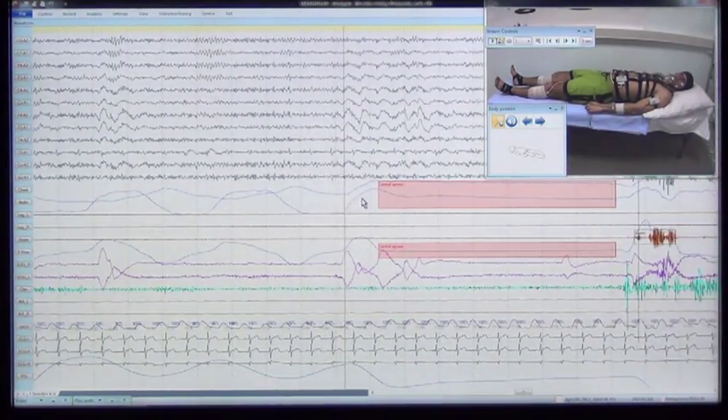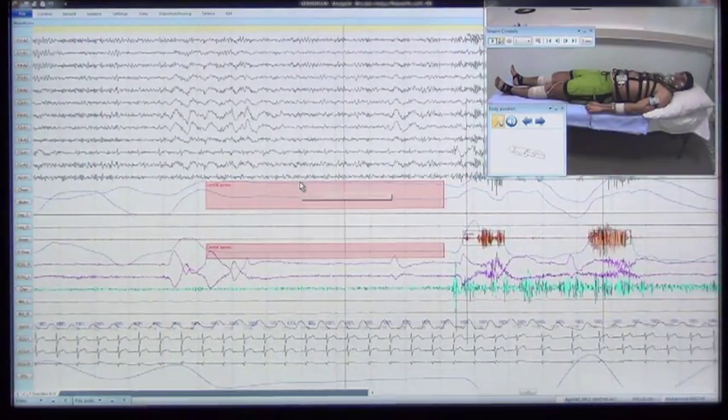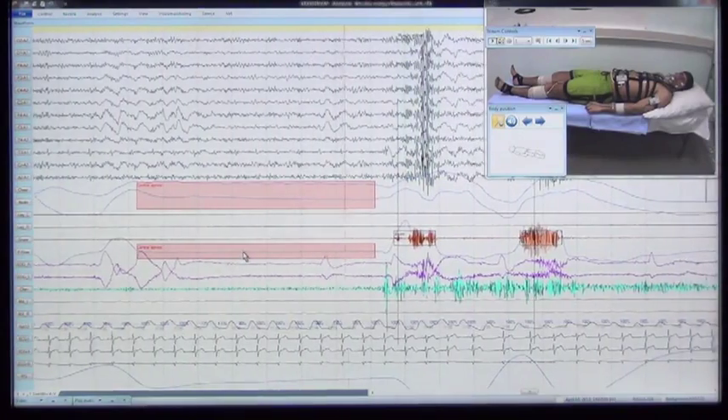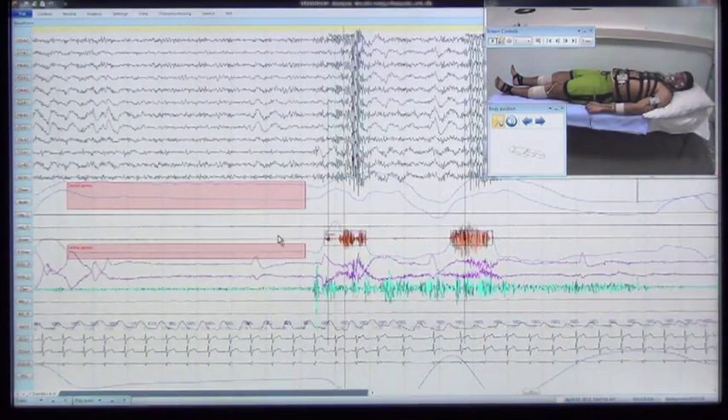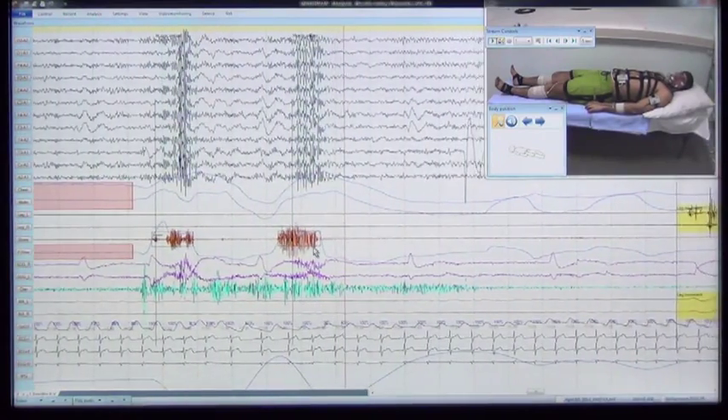The patient holds his breath, imitating central apnea. Straight lines appear in the channels of thoracic and abdominal breathing and airflow by pressure. Snore imitation produces a response on the chin EMG channel.